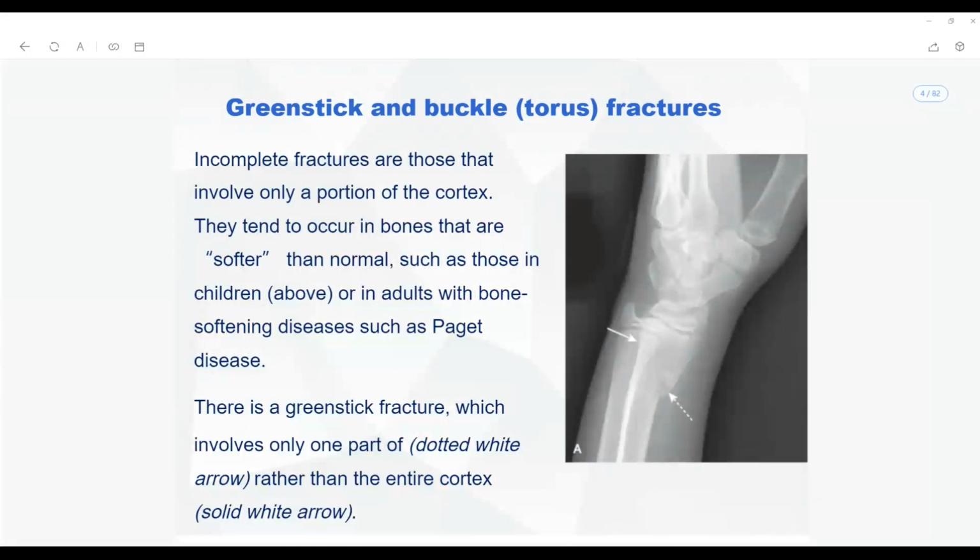A musculoskeletal radiograph has to be observed in multiple views. The most frequent multiple views are the AP, lateral and axial views. It is always compulsory. A skeletal radiograph has to be done in multiple views only. Don't prescribe just one view and stop.